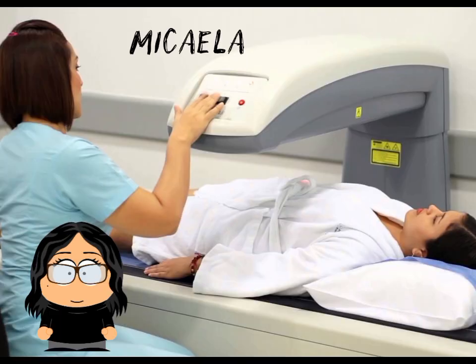Bone densitometry, also known as DEXA or DXA, is a test that uses low-dose X-rays to measure bone mineral density. It helps evaluate the effectiveness of treatment for osteoporosis and other diseases that cause bone loss.